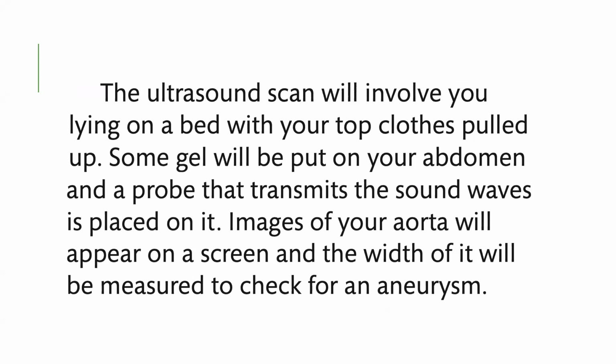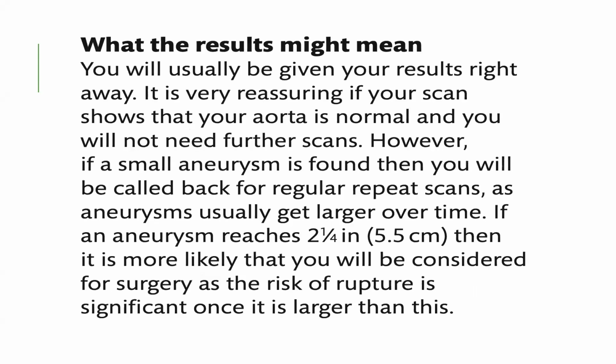The ultrasound scan will involve you lying on a bed with your top clothes pulled up. Some gel will be put on your abdomen and a probe that transmits the sound waves is placed on it. Images of your aorta will appear on a screen and the width of it will be measured to check for an aneurysm.